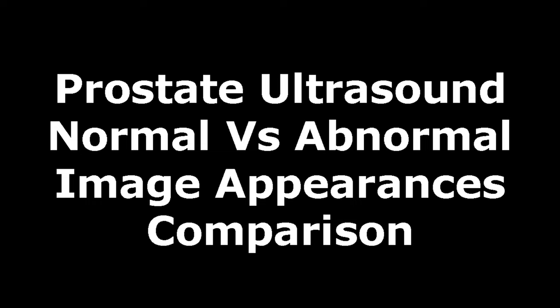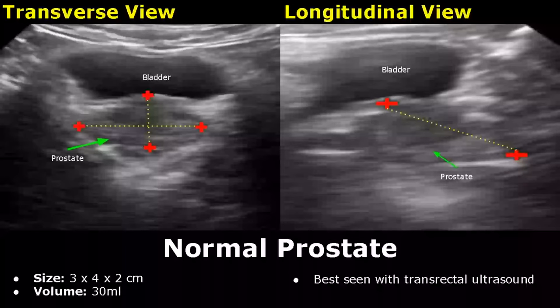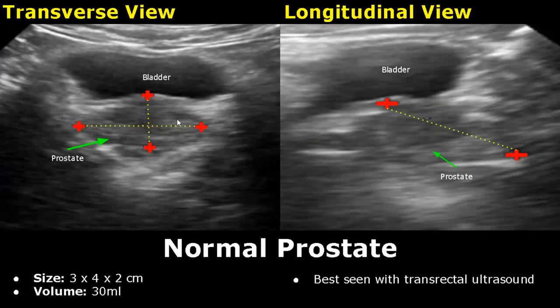Hello everyone, this is Dr. Sam and today we will study Prostate Ultrasound. Here we have transabdominal images of the prostate in transverse and longitudinal planes. The normal dimensions are 3x4x2 cm and the normal volume shouldn't be more than 30 ml.